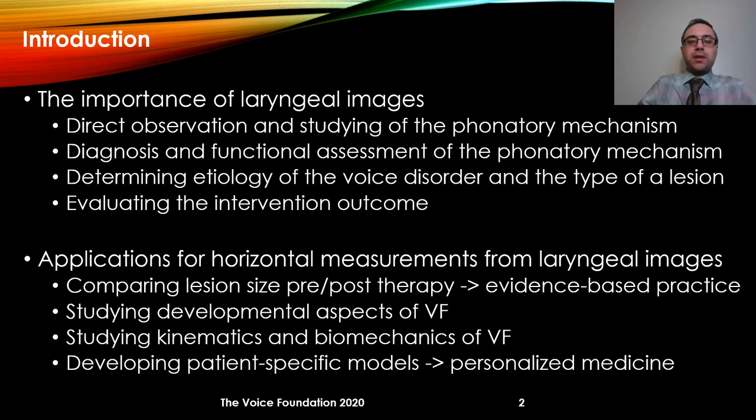We can use images for direct observation and studying of the phonatory mechanism. We can use them for functional assessment of the phonatory mechanism. We can use them for determining the etiology of the voice disorder and also the type of a lesion, and we can use them for evaluating an intervention outcome.